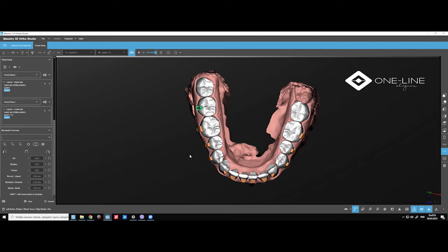Okay. Yes, this is one of the questions the dentist has asked. How do we reduce the thickness in the posterior? If we don't need intrusion, we just take it with the burr. I think he will say to grind it out or something else. Okay, so I can read it. How do we reduce the thickness in the posterior if we don't need intrusion?